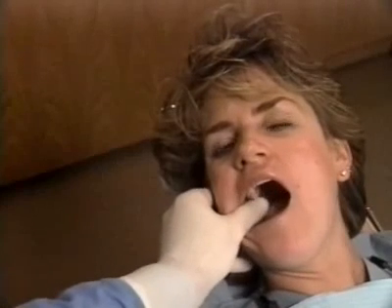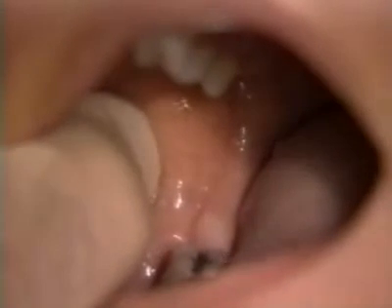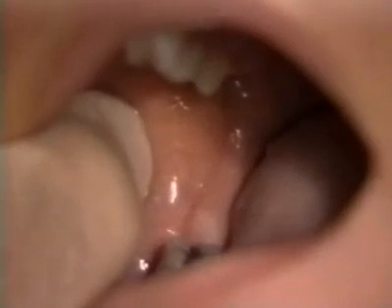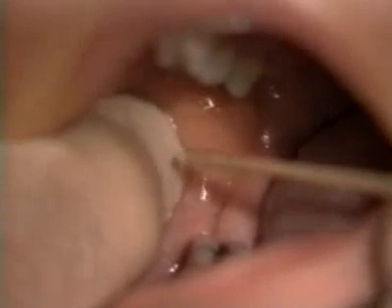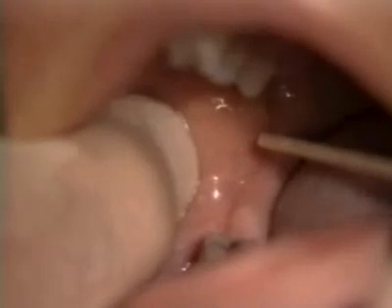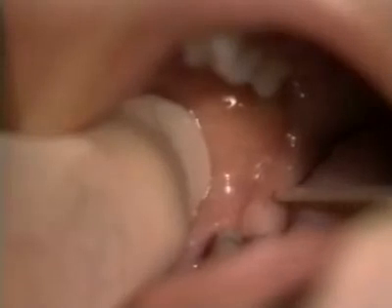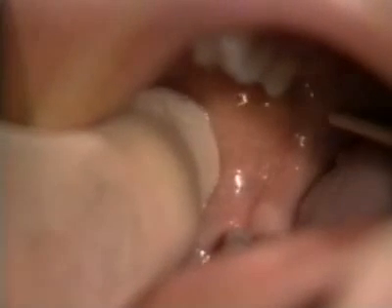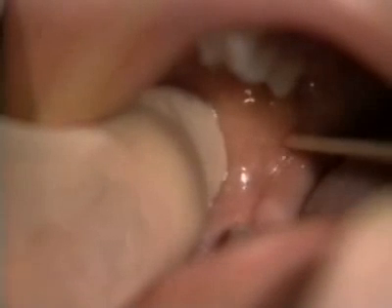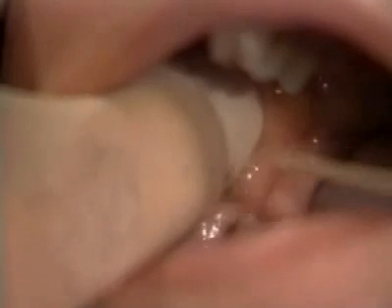Clinically, the coronoid notch is determined by palpating the most lateral aspect of the anterior ramus. Here, the thumb, kept parallel to the mandibular occlusal plane, is moved into position within the coronoid notch. A line bisecting the thumbnail establishes the height of injection. The insertion point itself is on this line just lateral to the pterygomandibular raphe, the soft tissue roll that denotes the junction between the buccinator and superior constrictor muscles and marks the medial border of the pterygomandibular space.